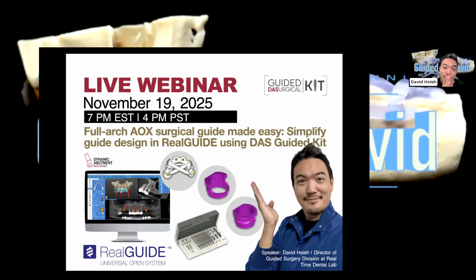So actually, today's webinar, we try to show that it is complicated at the end of the day, but we have different approaches. We can simplify things to make the surgery as easy as possible.